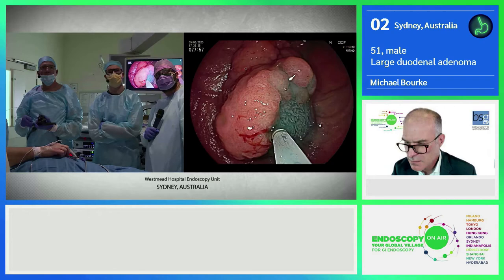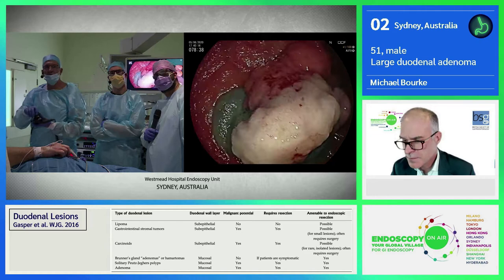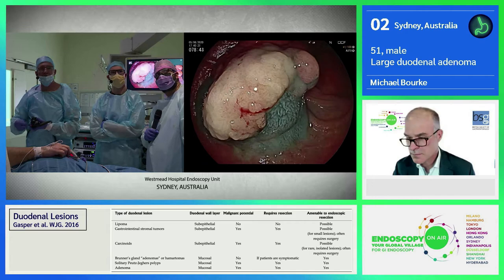I think we definitely do use it around the D1, D2 junction. And of course, Evelyn Decker's shown that you can see the papilla easily if you put a cap on the scope. In fact, most of the time you can see it with a current generation of gastroscopes because of the wider field of view.